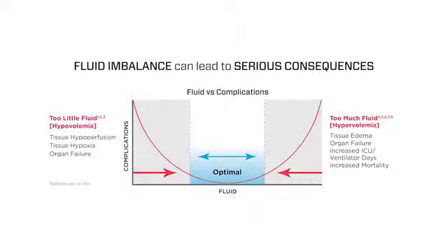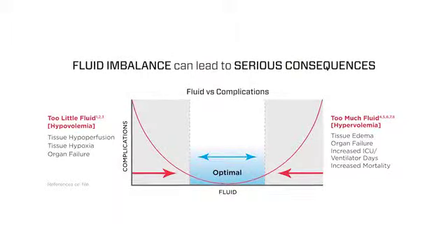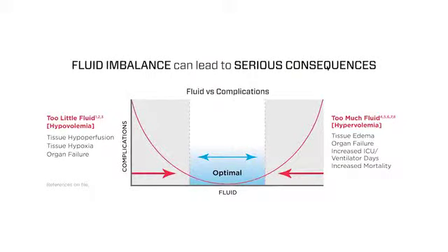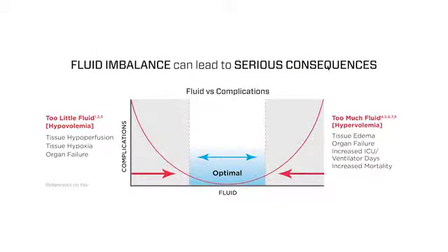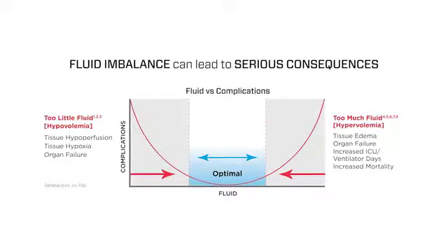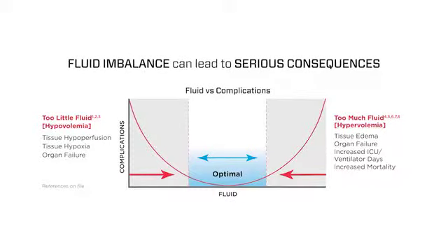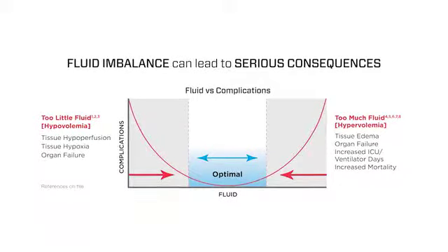Conceptually, we've known that we have increased complications with either giving our patients too much volume or not enough volume. You're going to see on your screen now the Bellamy curve, and what we see on this curve is that if I give my patient too much fluid, or if I give them not enough fluid, essentially I'm causing the same complications in my patient. What we see there is that every single patient has an individualized volume need. They have an optimal volume for that individual person.